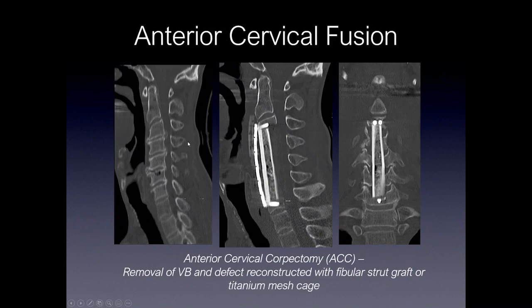Another type of cervical fusion that can be performed, if there's multi-level disease, is a corpectomy with a fibular strut graft or titanium mesh cage. In this example, there's multi-level disc disease due to disc osteophyte complex with severe spinal canal stenosis. This patient underwent multi-level corpectomy with placement of a fibular strut graft. Within the graft is bone graft material, and you can see a plate spanning these levels with vertebral screws.